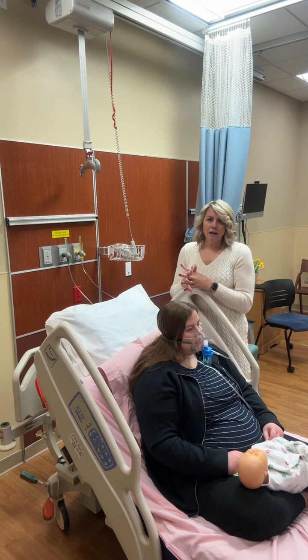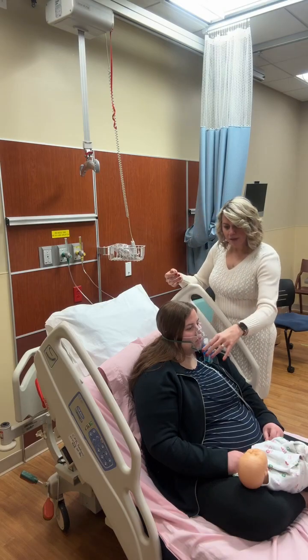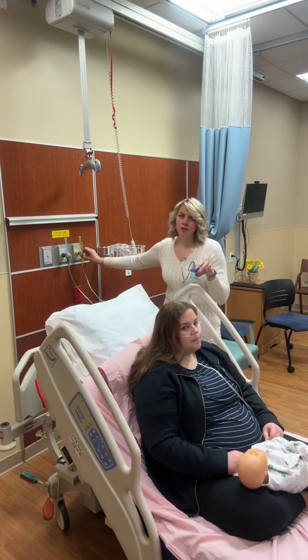This is going to go for about 10 to 15 minutes, and then after it's done, you'll start hearing it make a sound, and then I will tell her, okay, I'm going to take it off. Okay, so we're done with the neb. I'm going to take this off of your face, and then I'm going to turn it off.